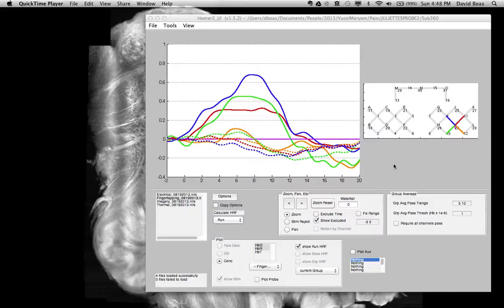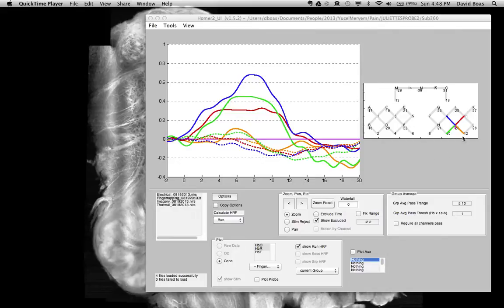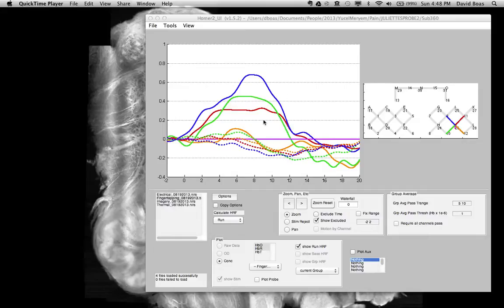There are two useful features that you may not be aware of related to plotting and selecting channels. Here I have an example where I've selected five channels corresponding with a single source. You can see the evoked response for all five channels.